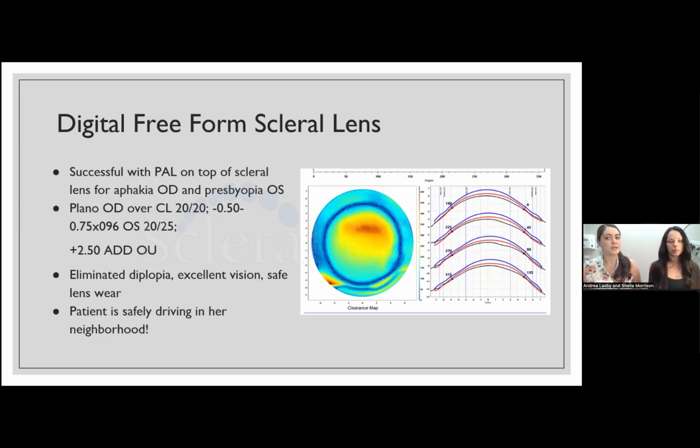And we'll often do pachymetry before we see the patient, before their fit even starts, and then after they wear the lens for about 4 hours, so that we can see, is their pachymetry increasing? Are they starting to get edema even before they start coming with the classic signs of, I see halos around lights and those sorts of things?